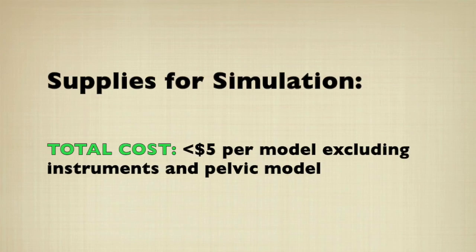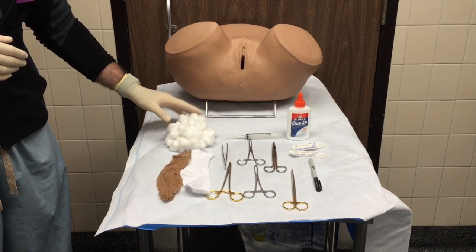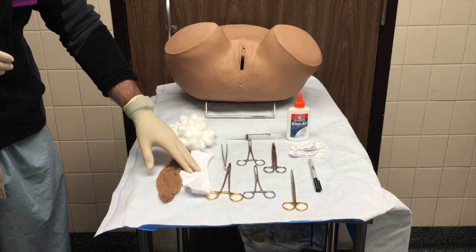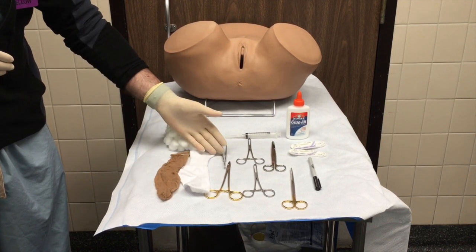The supplies needed to construct the model include cotton balls, a sock which serves as the vaginal epithelium, pantyhose which represents the fibromuscular connective tissue, and surgical instruments.